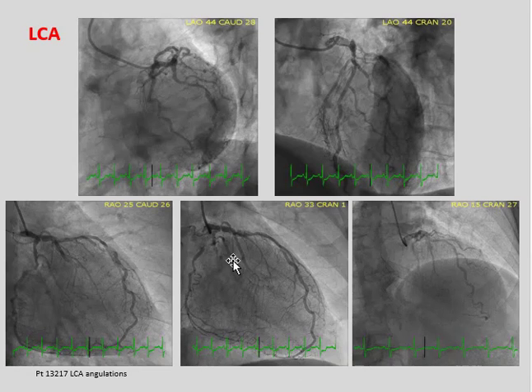Remember the ventricle, the heart in profile. The LAD goes along the upper margin, the anterior surface, and it sends off those septal perforators, usually at right angles, and diagonal branches. They all overlap because you're looking at a flat plane of a 3D image. And this is the circumflex. We only inject one vessel at a time, the circumflex wrapping around that aspect of the heart. So in these views in the RAO, you should always see the circumflex and the LAD.